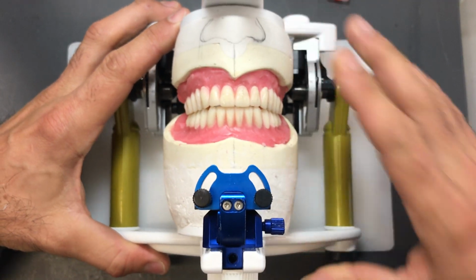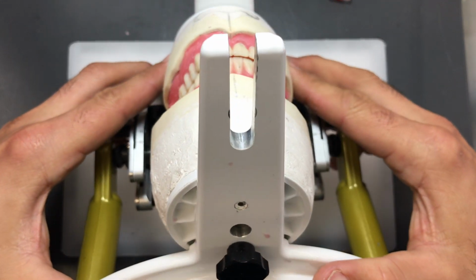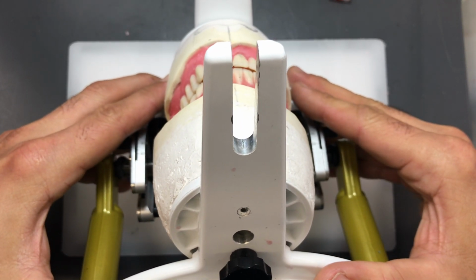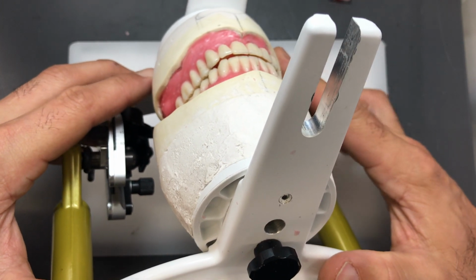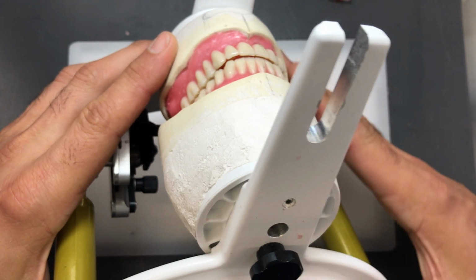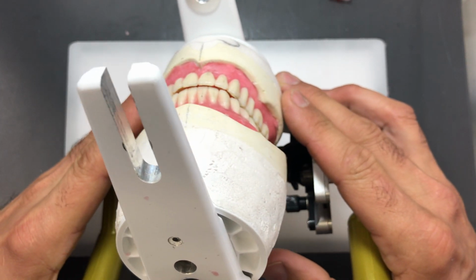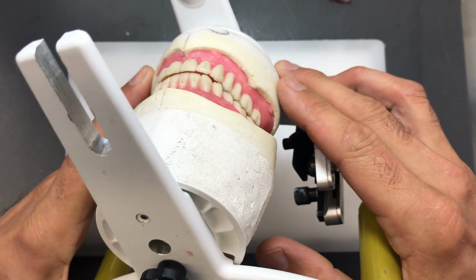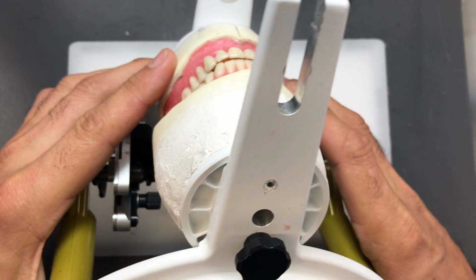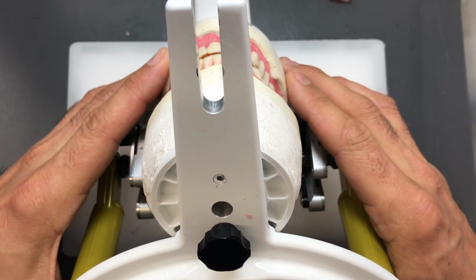So when I turn the articulator over, I'm just going to remove this incisal table. You should have a horizontal overlap or overjet, just like we had buccal overjet. Now we have labial overjet. And the overjet should be even throughout, between the distal of the 1-3 all the way to the distal of the 2-3. Try to keep it equal.